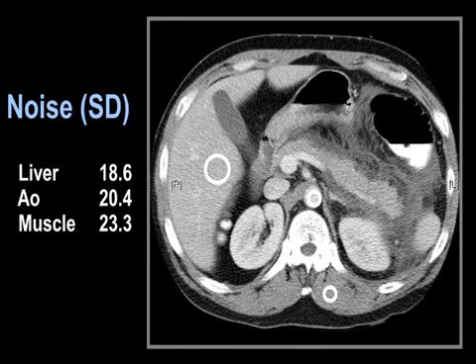So here's an abdomen CT scan. This is pancreatitis. And you can see the pancreas here and all this inflammation. So I don't do adult imaging, but I think my colleagues would agree. It's a pretty good example of pancreatitis, and it's a reasonable image quality here. And taking regions of interest, several areas, we sort of got a mean Hounsfield unit of 21 or 22. Okay, and that's probably a target for some noise indices, say, on the GE scanner.